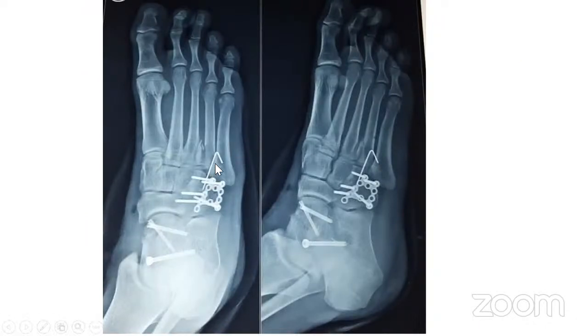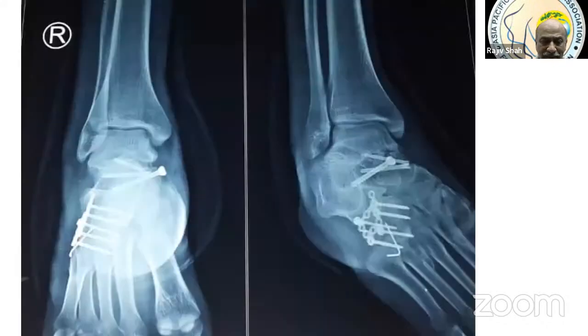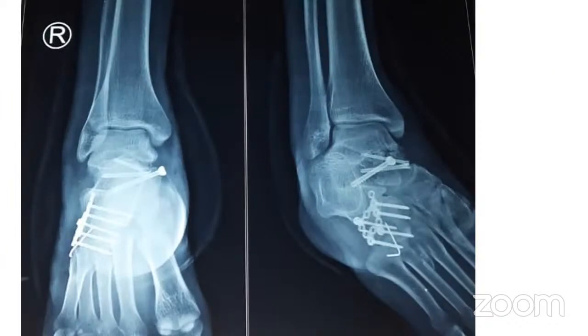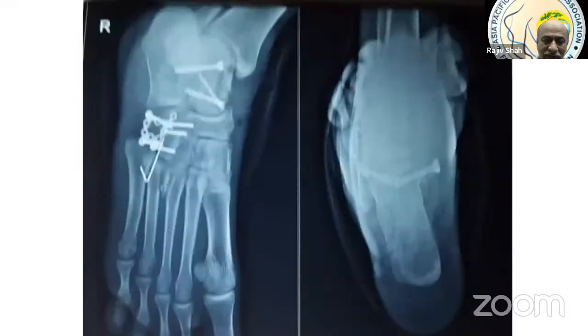Okay. So I accepted this once I reconstructed these joints nicely. So he is under treatment. It's just 2.5 months. This was the X-ray 15 days prior. But the message I want to give is that a cuboid fracture in an adult patient requires to be reconstructed. Is that the plate that you were trying to explain by drawing the diagram? No. This is a specific cuboid plate, a Synthes plate. A fragment-specific plate.